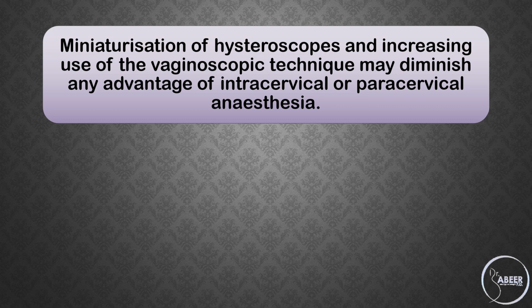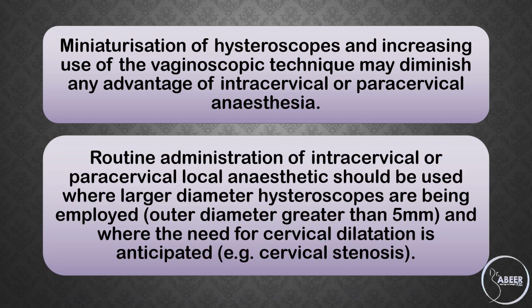Miniaturization of hysteroscopes and increasing use of vaginoscopic technique may diminish any advantage of intracervical or paracervical anesthesia. Routine administration of intracervical or paracervical local anesthetic should be used where larger diameter hysteroscopes are being employed with an outer diameter greater than 5 mm and where the need for cervical dilatation is anticipated, for example, cervical stenosis.